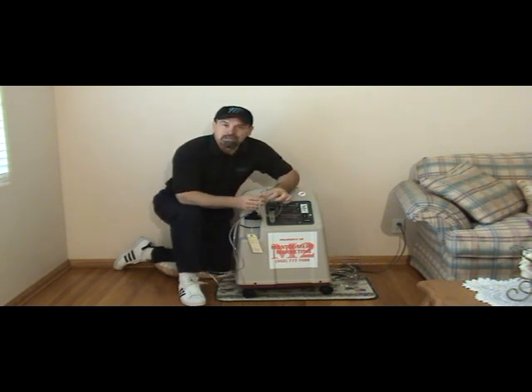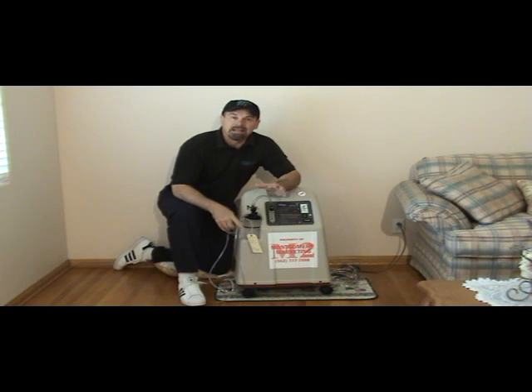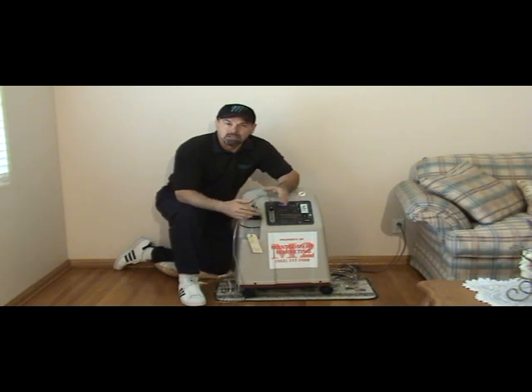Now sometimes you have patients who are more mobile. And one of the things we try to do is we try to maintain patients' dignity as much as possible. One of the ways to do that is if a patient is on oxygen continuously and they need to get up and use the restroom, or they would like to get up and sit in a chair, you want to allow them to do that and make it as easy on them as possible. So one of the ways to do it is by providing an extra length of tubing so the patient can get up and move around.